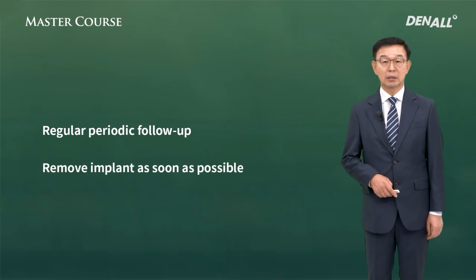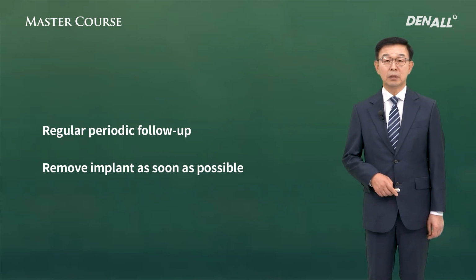If the implant has migrated into the sinus, you need to remove it as soon as possible. To be able to do this, you need to know the right techniques to remove the implant ahead of time. I believe that would help you a lot.